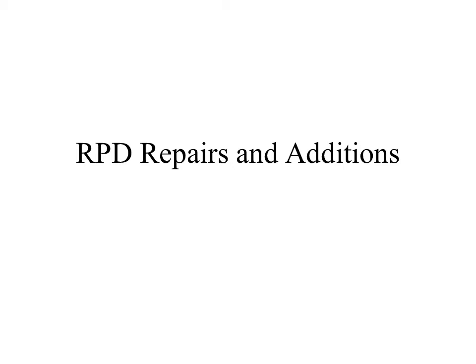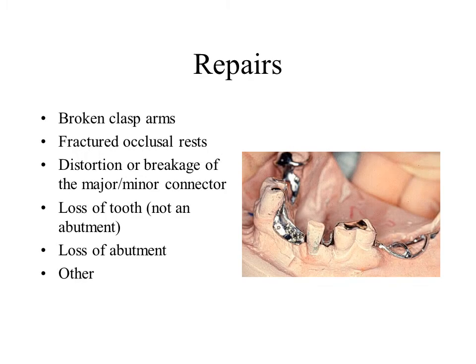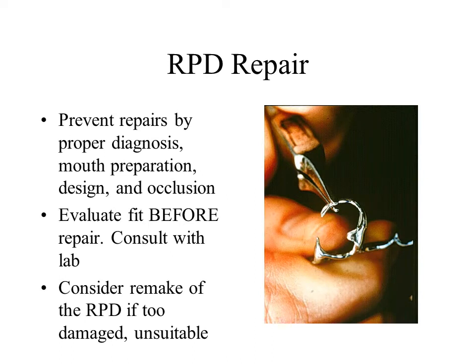Repair the RPD. The need to repair the RPD will occasionally arise. Many situations can be avoided by careful planning. Occasionally repairs can be anticipated to increase the service life of the RPD. The patient should be educated on proper placement and removal of the RPD, as well as meticulous oral hygiene and regular recall visits.